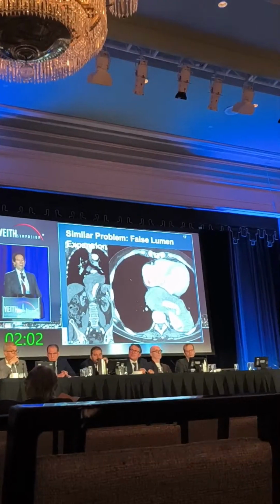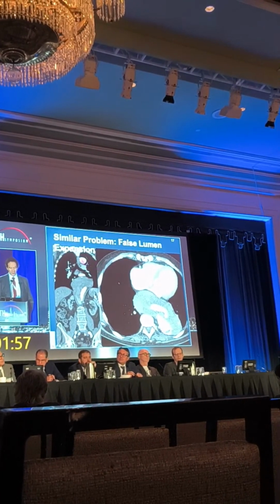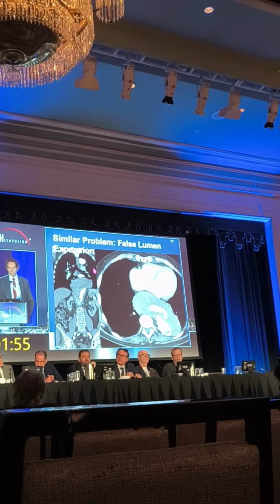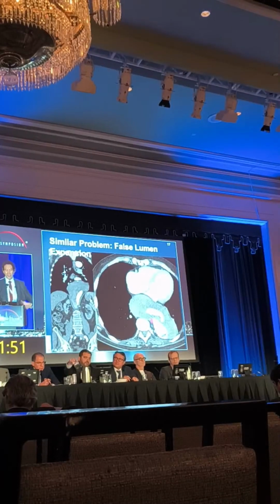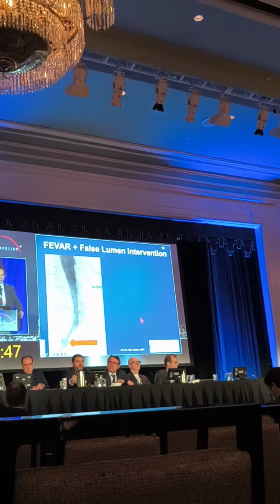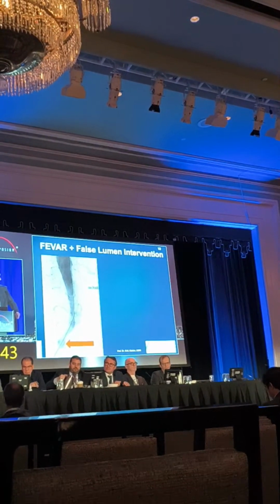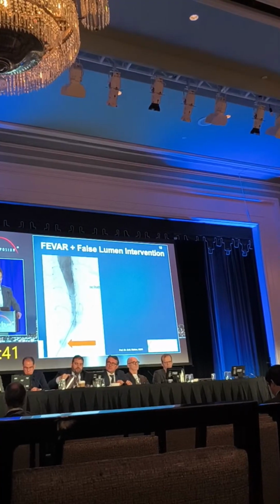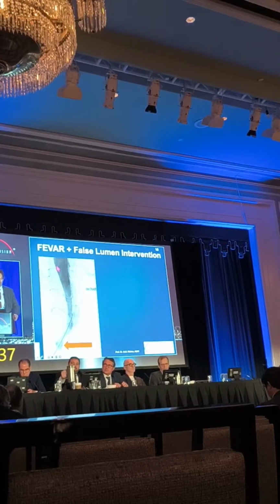A very similar patient also had false lumen expansion secondary to his FET procedure. And typically these patients have inflow and through-and-through flow in the false lumen. Here the big question was, Thilo, perhaps you might have put a candy plug in here, but we were shy of doing that because we saw so many inflows.